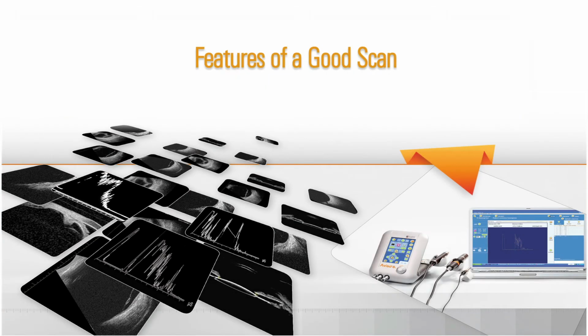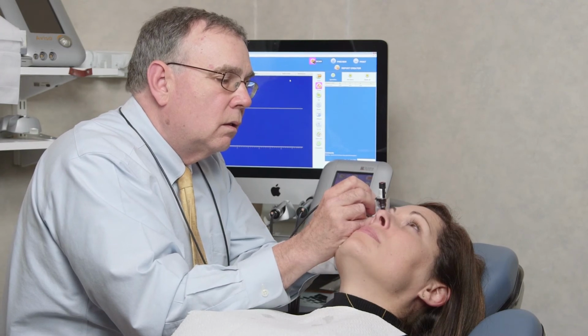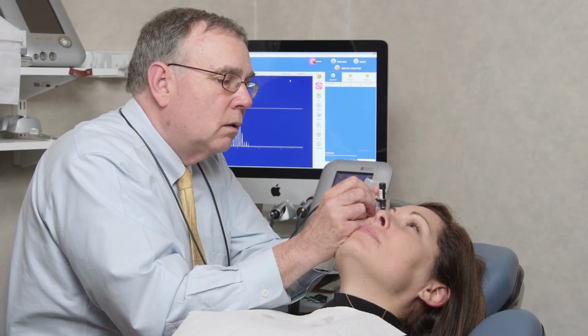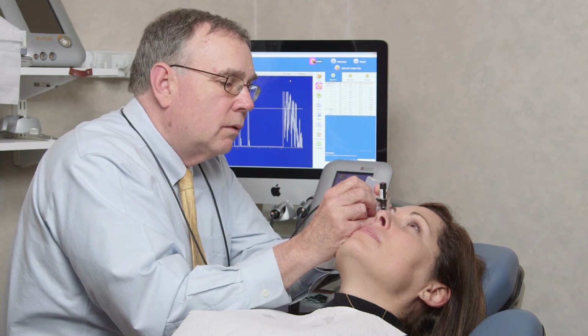Features of a good scan. IOL power calculations should be based upon the best scans obtained, and suboptimal scans should be discarded. So the examiner must know the features of a good scan.